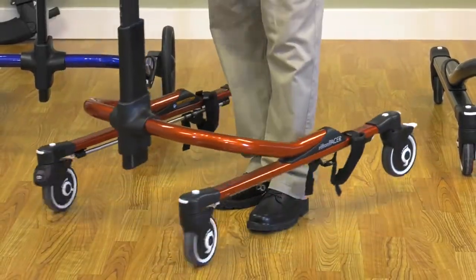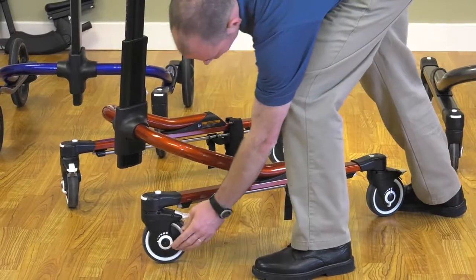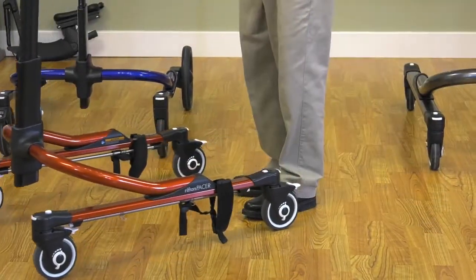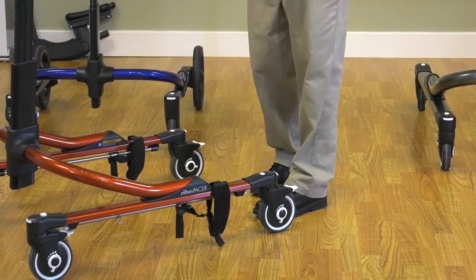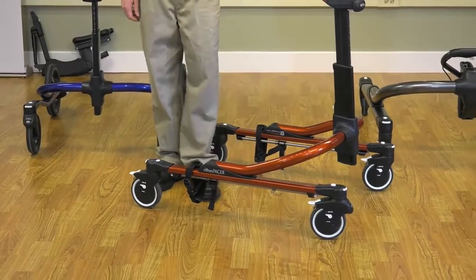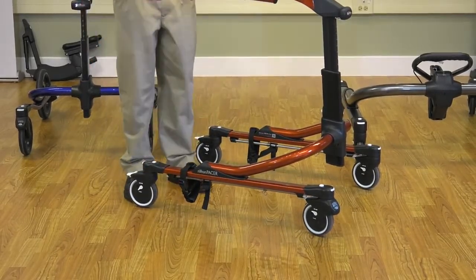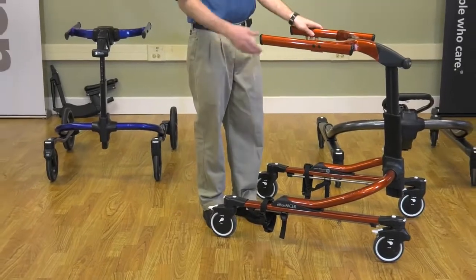And then two other features we have, just like always, are the drag feature. So you can go from light resistance all the way back to heavier resistance, and that gives you resistance for when you have a client in the Pacer and you don't want the Pacer to run away with them. So that's the same feature, just better marked with those nice new bars there. And then we also have an anti-reverse lock, so that it makes the caster go forward and not backward with a ratchet like that. So those are your four caster features.